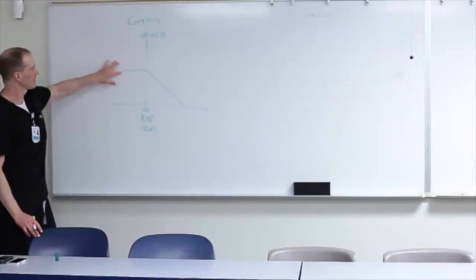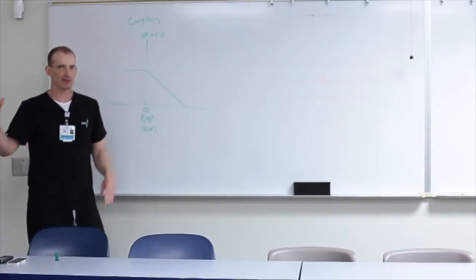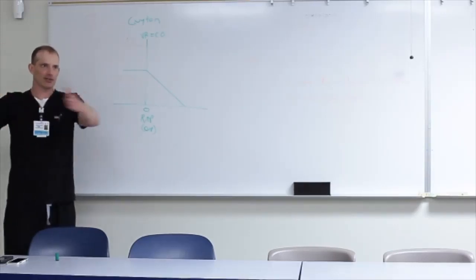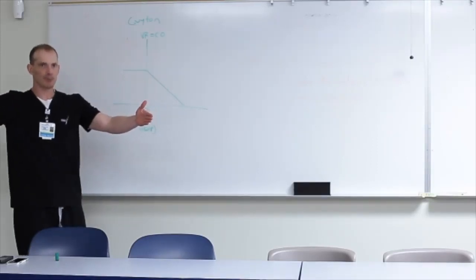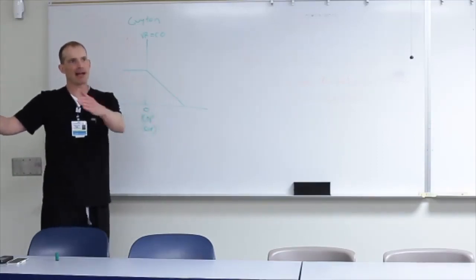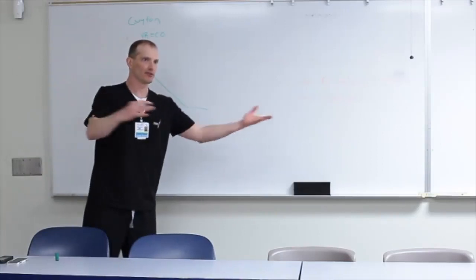Okay? This is called the waterfall area. If you think about a stream flowing, and you pick a spot like 100 feet upstream and go down the stream from that spot, there's going to be an upstream pressure, and then there's going to be a downstream pressure, right? The downstream pressure is going to be backing up the river a little bit, but the upstream pressure is higher, so the river flows, right?